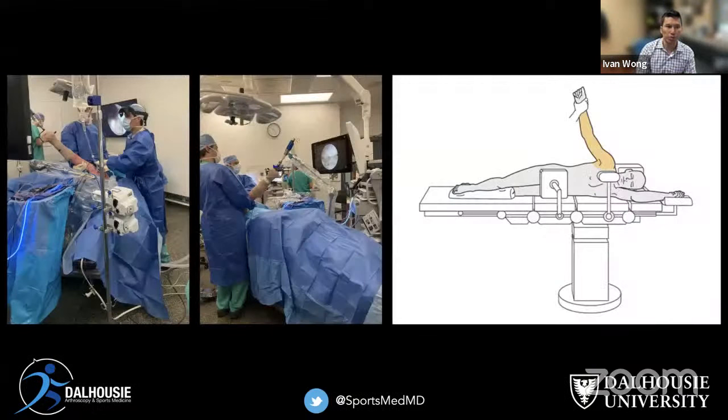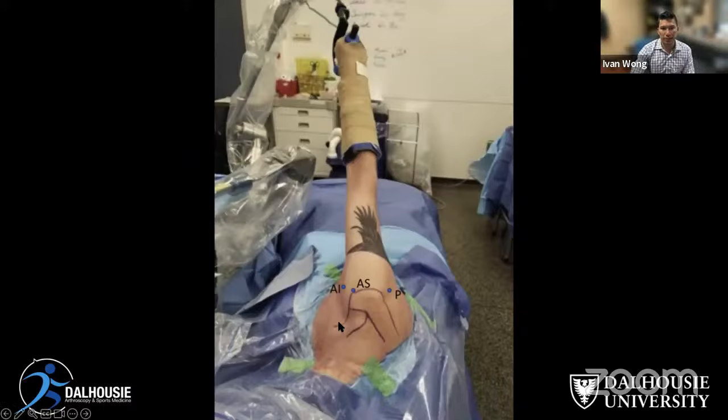In the operating room, the patient is in the lateral decubitus position because we get a better view this way. I use augmented reality during surgery as well. We use three portals: a posterior portal where we start, an anterior superior portal where we view, and an anterior inferior portal which is our working portal and where the traction suture comes from.